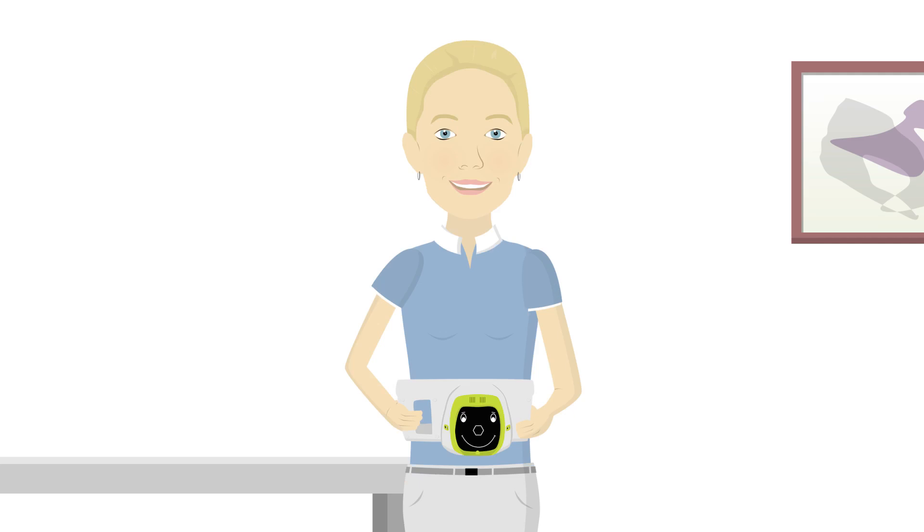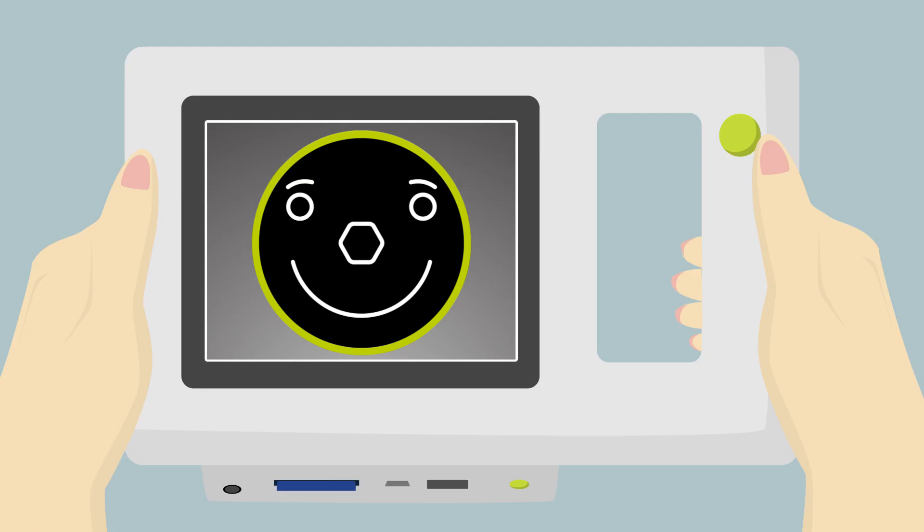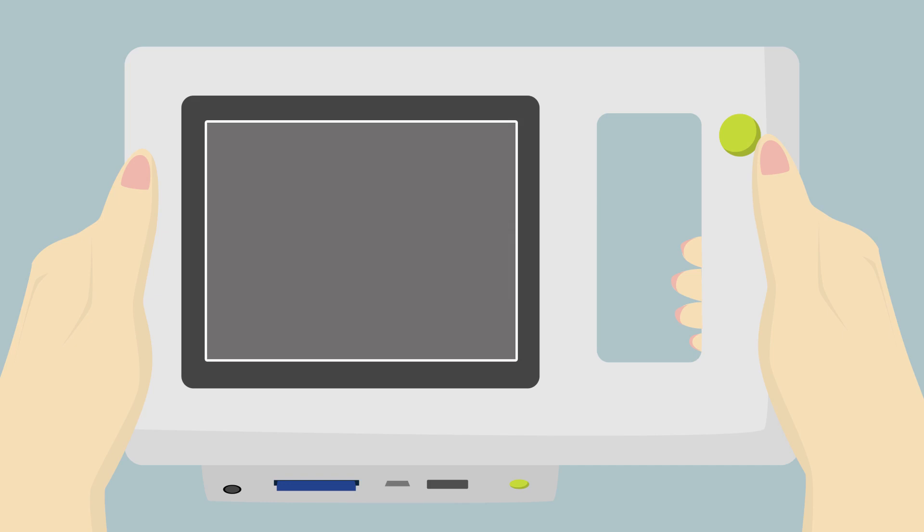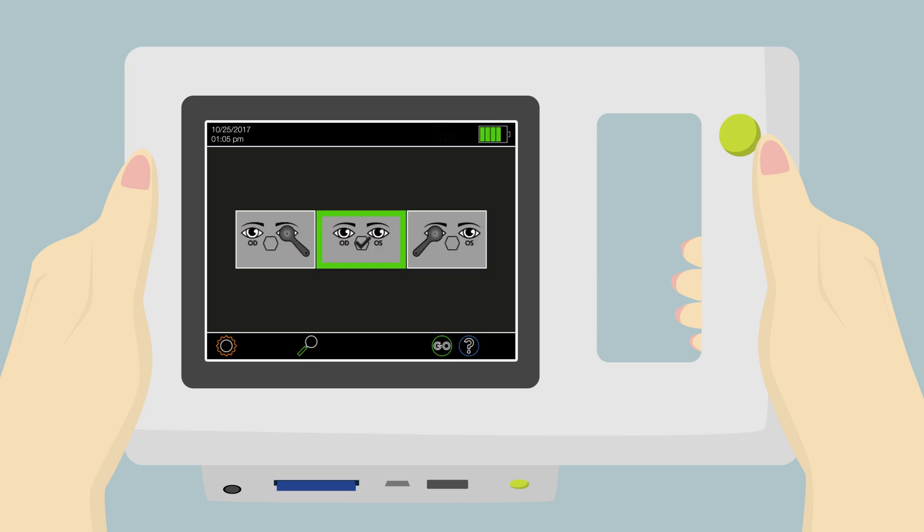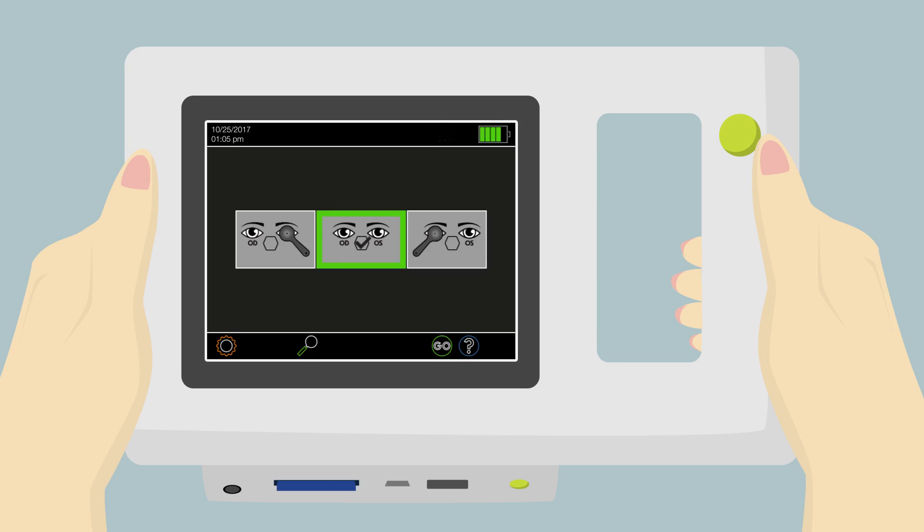The screen will change several times during this period, including a momentary blank screen. This is the home page. From here, we can adjust the settings of the device or start a new measurement.